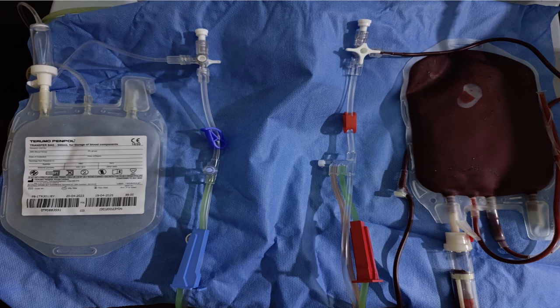For visual purposes, we have kept all this on a flat surface. As we can see, the PRC is connected to the BT set. The blood transfusion set is primed with the PRC unit first, and then it is connected to the inlet line depicted by the red clamp using a three-way connector.